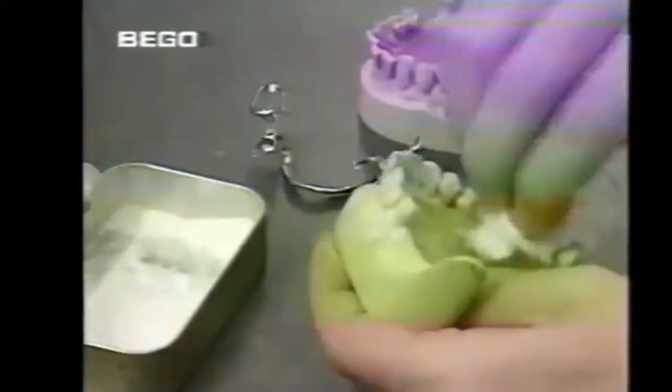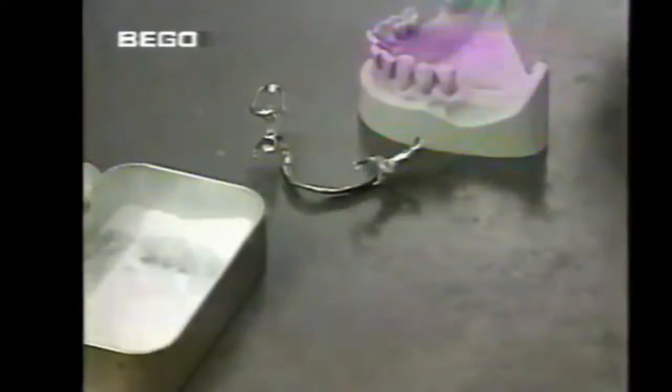The frame is now placed on the model. Sprinkling talcum powder on the plaster teeth allows the polished frame to slide onto the model easily.